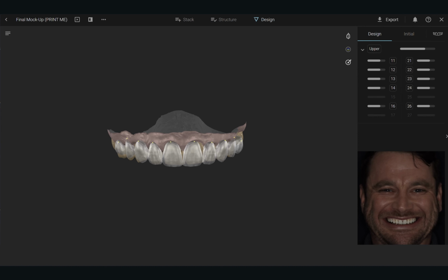And it does a good job of translating the 3D from the 2D. A lot of criticisms previously have been that, oh, you can't change a 2D into a 3D because it just doesn't work in terms of the spatial positioning. People would just say, no, it can't be done. But the algorithm that they've developed means that it can.